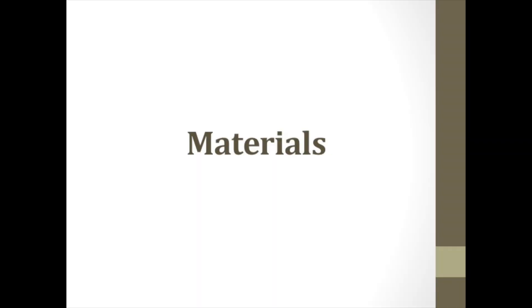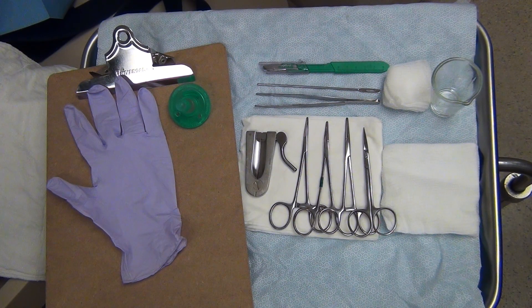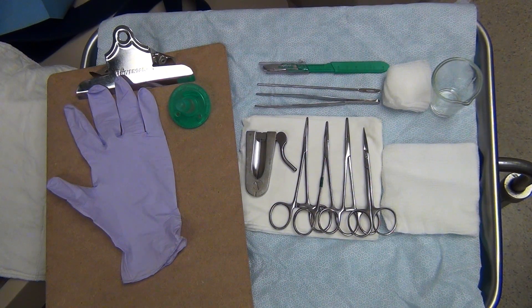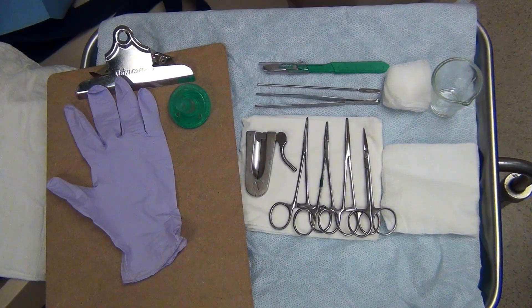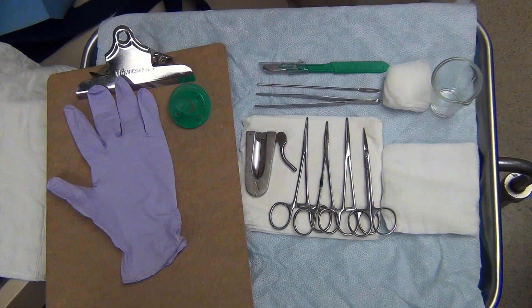All of the materials used to construct the circumcision model can be obtained on a hospital postpartum ward. The materials list includes an infant pacifier, nitrile glove, clipboard, and a circumcision set with either a Mogan or Gomco clamp.